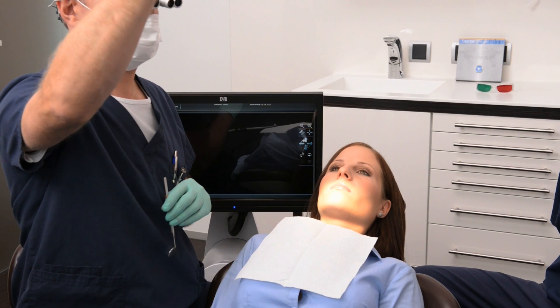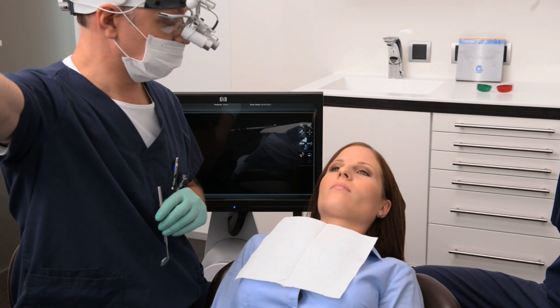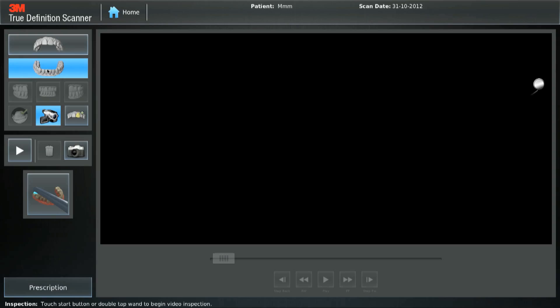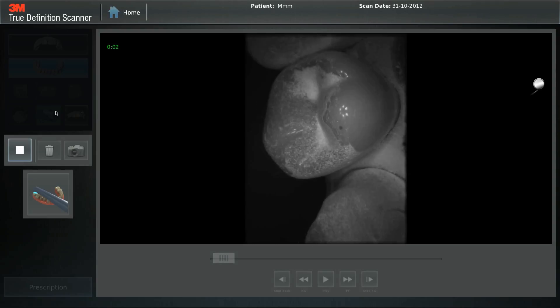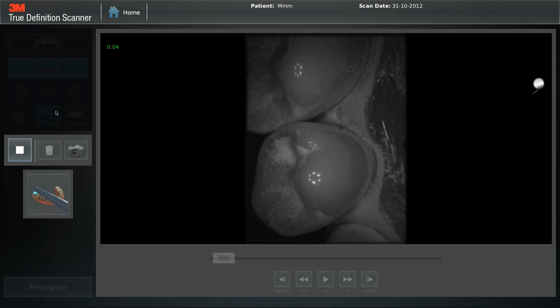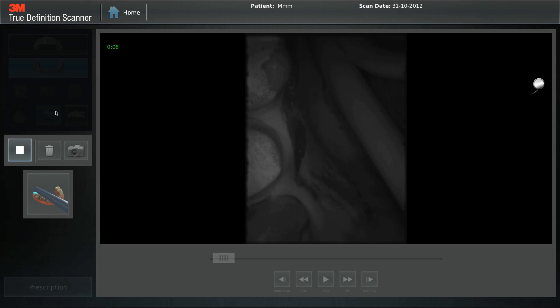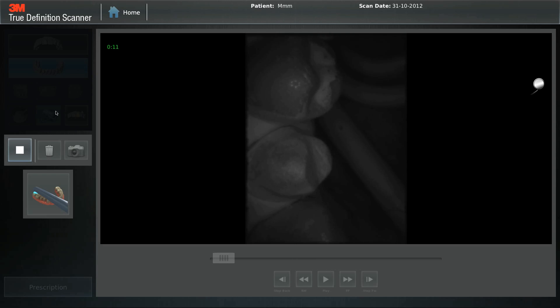Preview the preparation. Anyone working with magnified dentistry will realize the importance of seeing the preparation in a magnified view. Select the video camera icon from the left to start a video preview. By previewing the clinical situation before scanning, obstacles like underpowdering and blocked margins can be avoided.